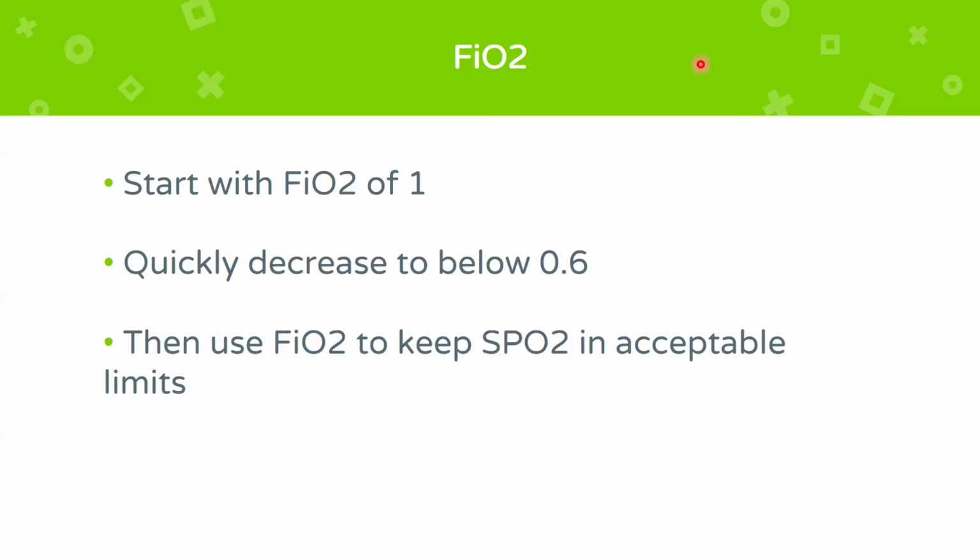A pulse oximeter will never detect hyperoxia, so you don't want our patient to be having an SpO2 of 100%. So aim for a saturation of 95 to 98% in normal lungs. In ARDS and such conditions, we will aim for a lower saturation, which we will see in other classes.